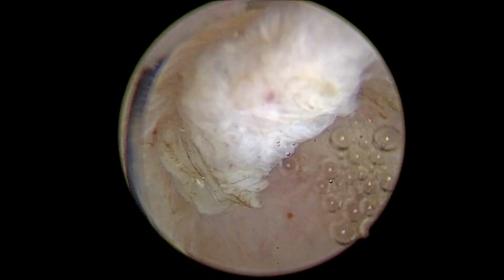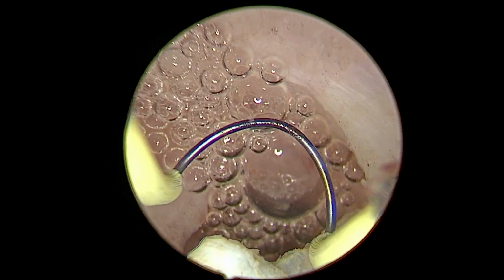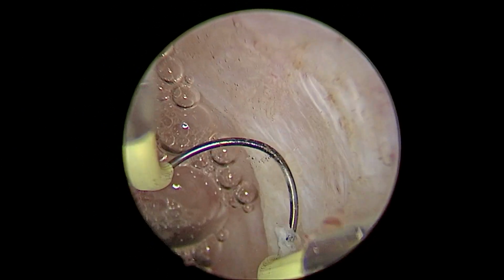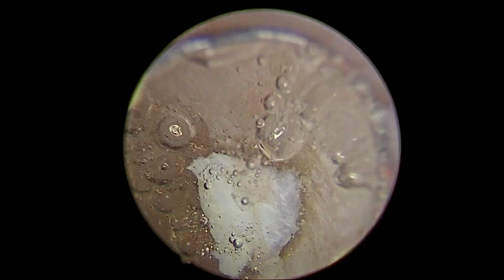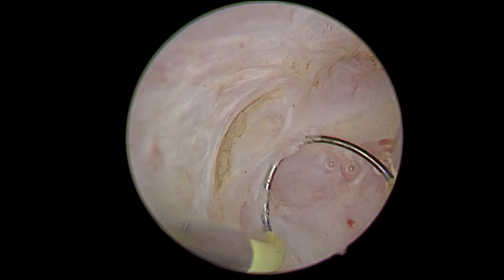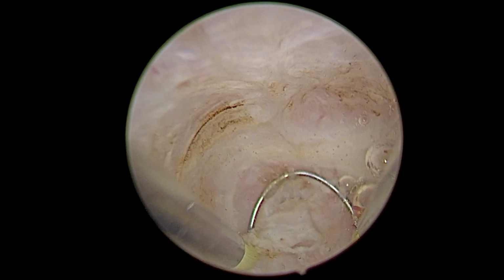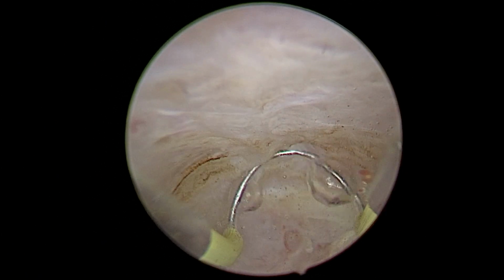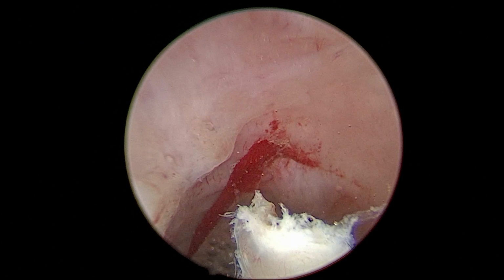So here you can notice very slow and gentle movement of the resectoscope. The resectoscope that I'm using is a bipolar resectoscope, 22 French size, and there are three things that I'm doing. One is I am taking out the entire endometrial tissue which is there in the isthmocele area. Second thing, the depth of the isthmocele is being resected. Third thing, the slope of the isthmocele is made more soft. So these three things are done in the hysteroscopic correction of isthmocele.